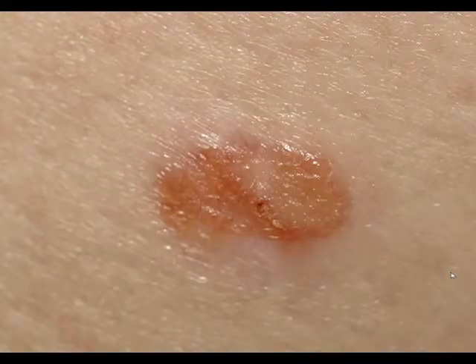Here's another example of another lesion. Clinically, dermatoscopically, now we have linear vessels, not dotted vessels. Some of them are looped, some of them are coiled, some of them are even serpentine, but the arrangement is random, not specific.